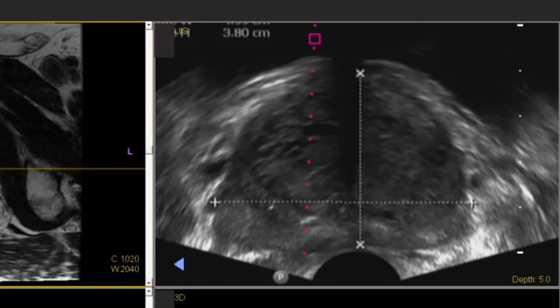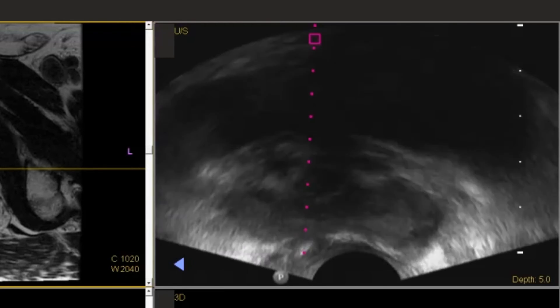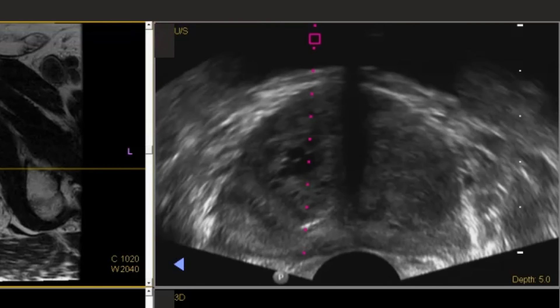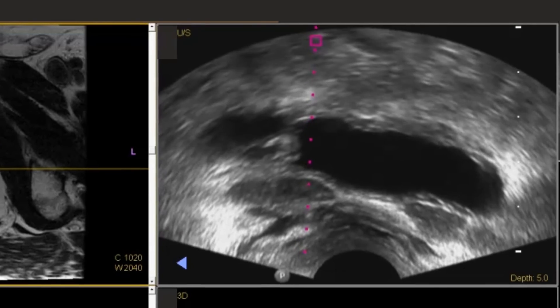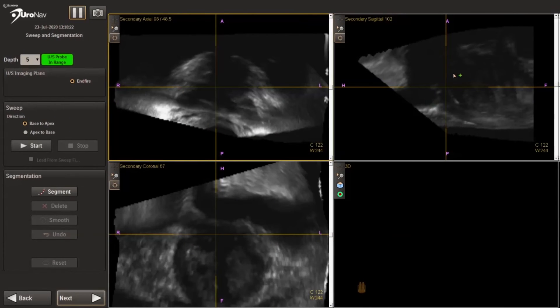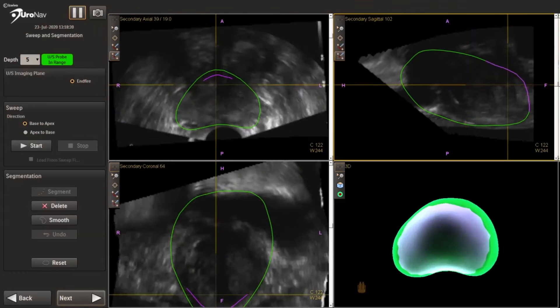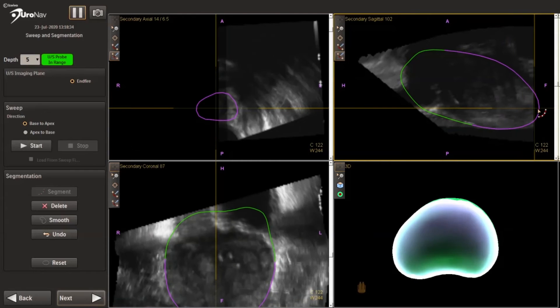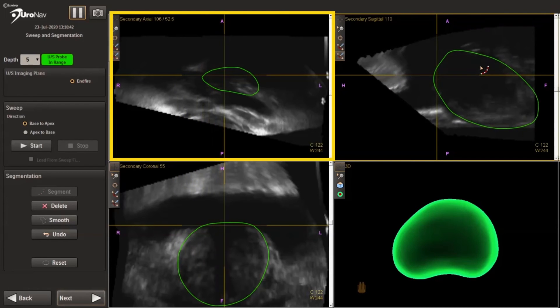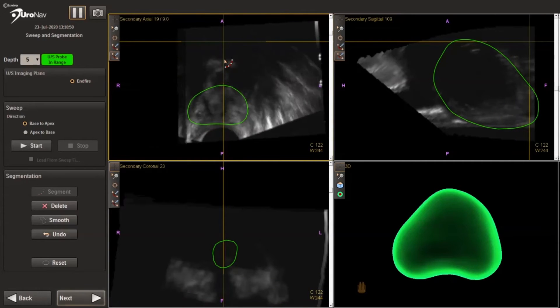I then will sequentially examine the prostate from the base and seminal vesicles to the mid-gland to the apex in the transverse plane, looking for any obvious hypoechoic nodules or abnormalities. At this point we do a handheld sweep through the prostate in the transverse position, which the software platform captures, and then my assistant draws the boundaries of the prostate. We then make sure that the automatically generated contour appears appropriate, altering borders in the sagittal plane first, then moving to the transverse plane to confirm the calculated images look correct.